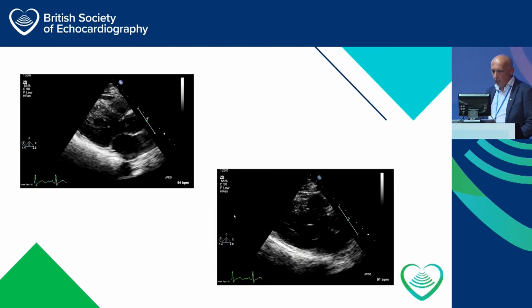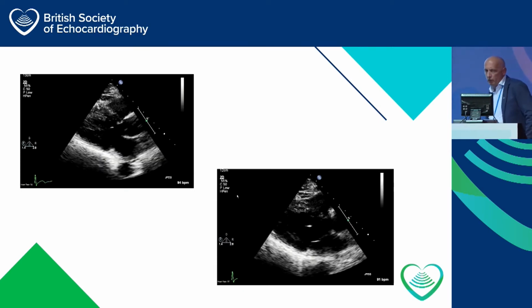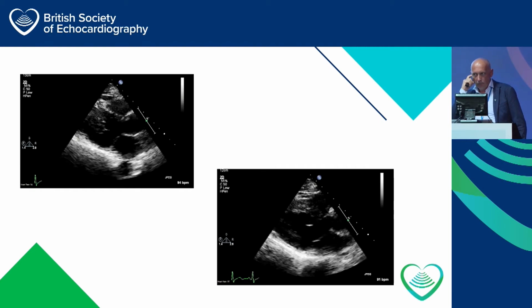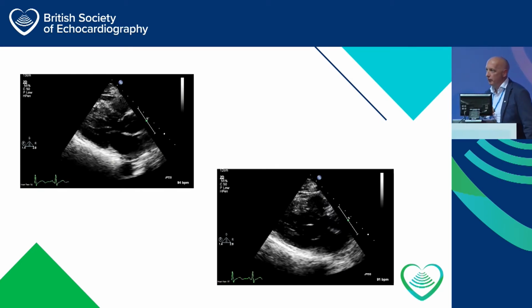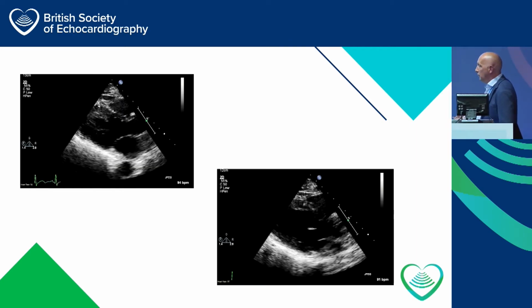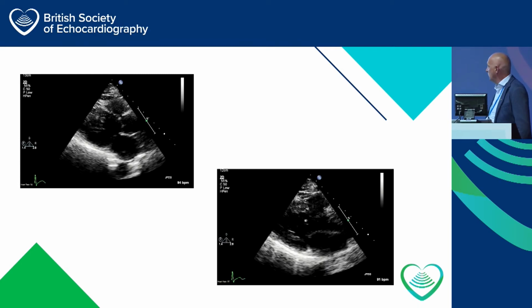So this is her echo. Again, I think these are down probably enough. So you've got two pictures, both parasternal long axis. What do you see? Anything? Who's going to be brave enough to put their head above the parapet? A trainee, maybe? Nobody? Okay. Parasternal long axis looks to me like it's normal function. I'm not really too worried.